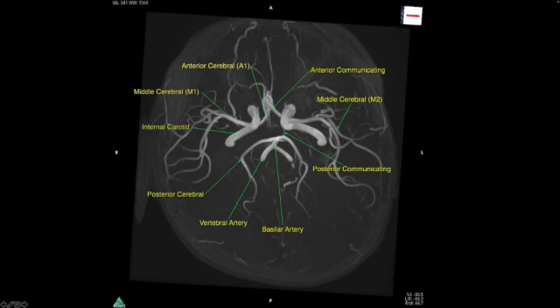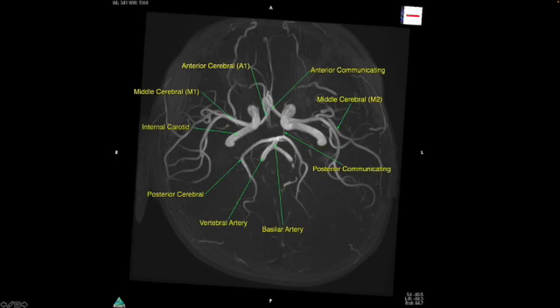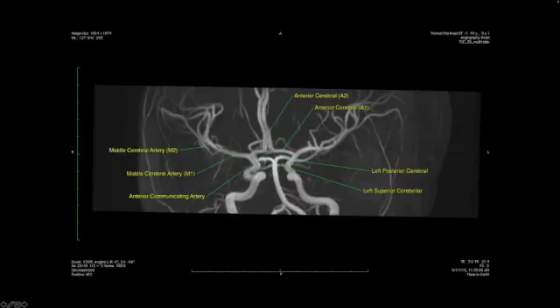Same thing on the right side. The posterior circulation is here — the vertebral arteries, the basilar artery, and the bilateral posterior cerebral arteries, which extend posteriorly. You can see the posterior communicating artery at least on the left side, connecting the anterior and the posterior circulation. There's also an arrow on the anterior communicating artery connecting the left and right sides of the anterior circulation.